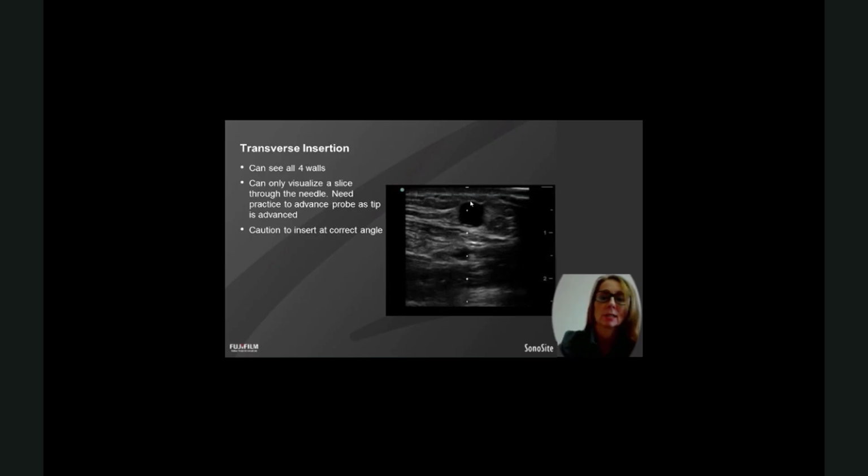If you're inserting a little bit off centre and you've got the marker the wrong way round, when you try to correct, because you see you're coming in a little bit over to the left here, you'll try to adjust to the right, but your needle will keep moving more left, and that's because you've got your marker on the wrong orientation here. So remember that when you've got your probe on, move it to the left, and your vessel should move to the right, move it to the right and your vessel should move to the left. And that way, if you come in a little bit crooked and you decide you want to straighten up to the right, it'll go right when you think it's turning right and you won't have confusion.